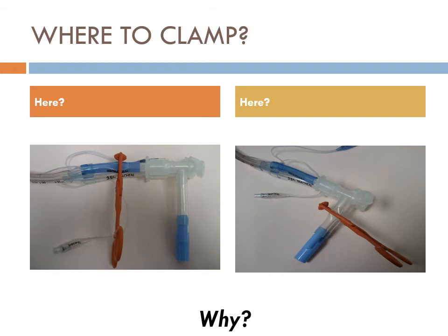Now, if I said, perfect, don't put the bronchial cuff up, let's just ventilate both lungs, and you didn't have this piece, and you hooked up the tracheal because that's what you're most used to, are you going to be ventilating them? I want the same outcome, except if you're new and you don't know how to use this, if you start ventilating through the trachea, all the air is going to come right out of the bronchial tube, because this is open.